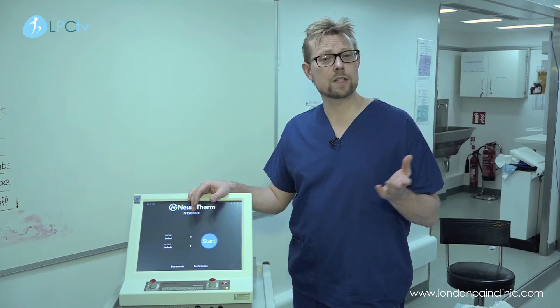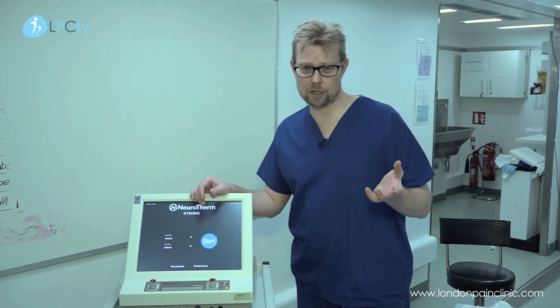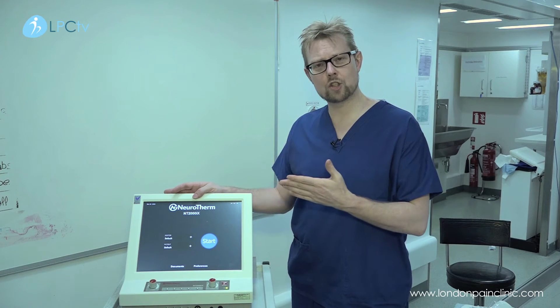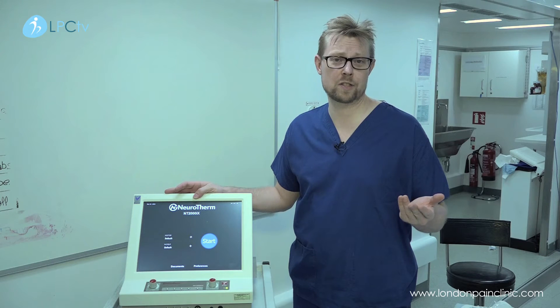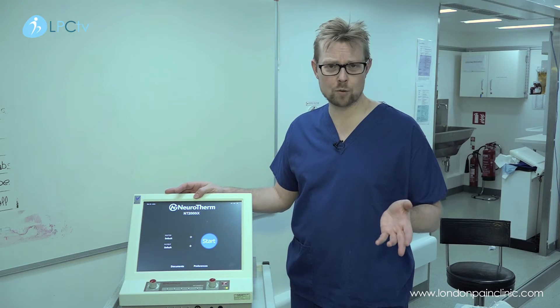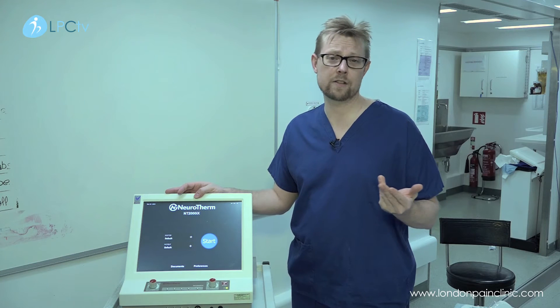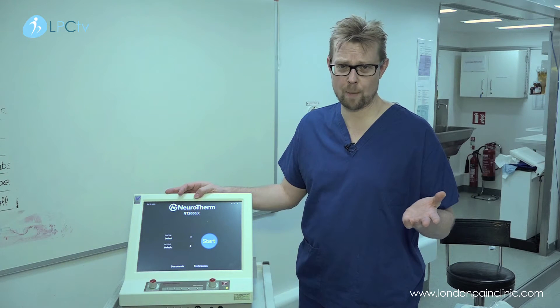Pulsed radio frequency is a non-destructive type of radio frequency, and we use this treatment to treat nerves essentially — nerves all over the body which are dysfunctioning and causing a variety of different types of nerve pain or neuropathic pain.